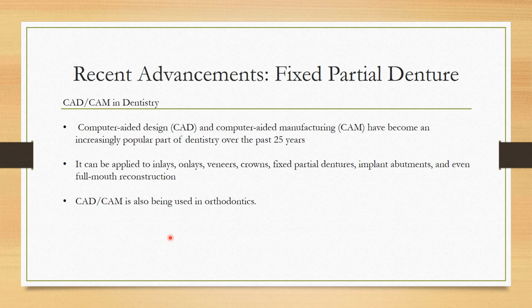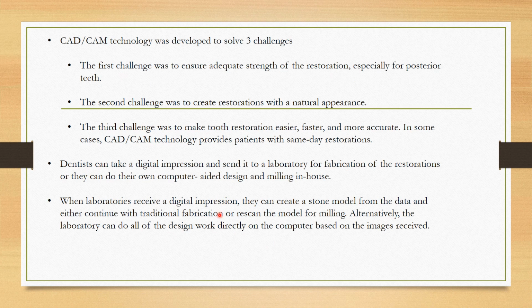So it can be applicable for veneers, crowns, inlay, onlay, FPD, implant abutment, even a full mouth construction can be done. Okay, it can also be used in orthodontics.